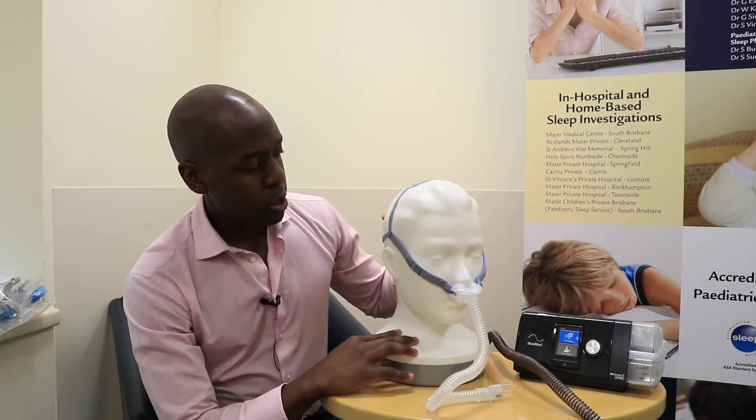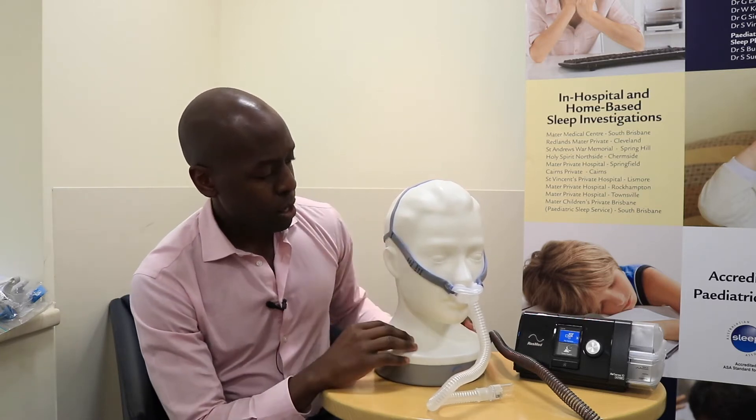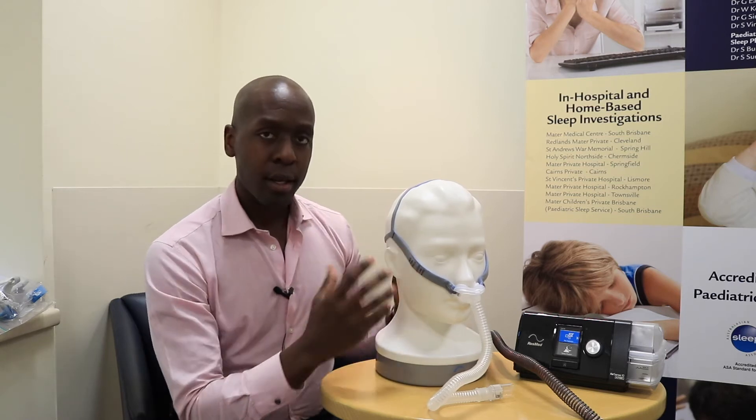Now, this is a non-adjustable mask, so once the headgear starts getting stretched the only thing you can do is use the clips that come with the new mask to basically shorten the head strap.